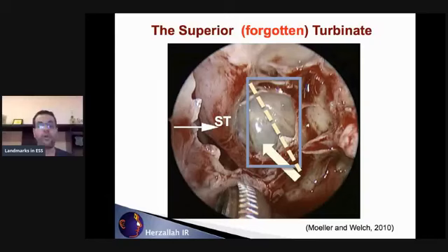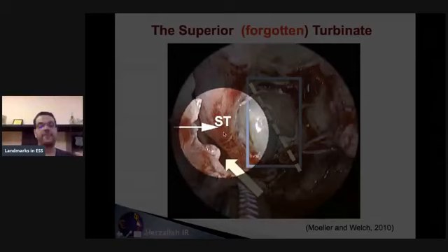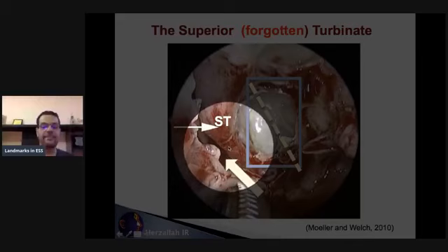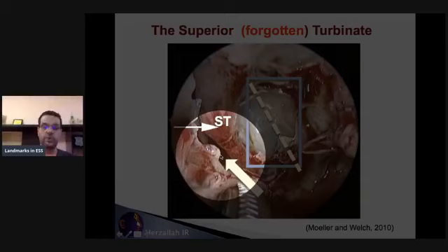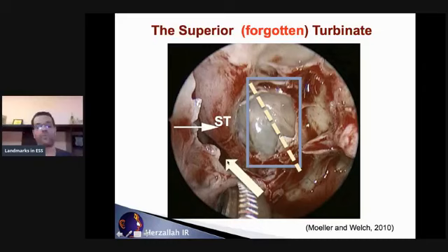What we actually do is we identify the superior turbinate, and then enter in the region between it and the posterior border of the middle turbinate, which is this. See, this region is pretty important. You have a window that I just showed in the first few images, a window that lies between the superior turbinate and the middle turbinate. But now I'm not looking at this window from the nasal view, I'm looking at it from the transethmoidal route, right? So now I'm entering into this region, and then it's just entering transnasally to identify the opening of the sphenoid sinus just medial to the superior turbinate inferior third.